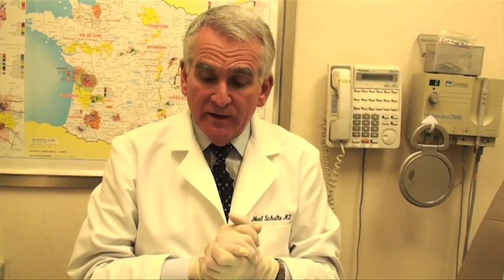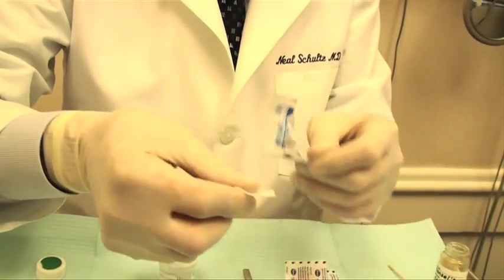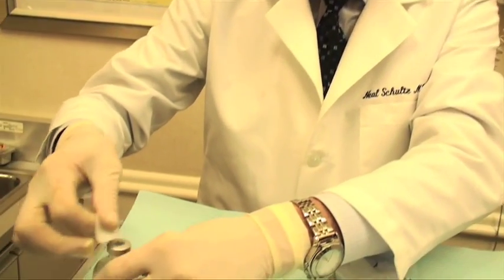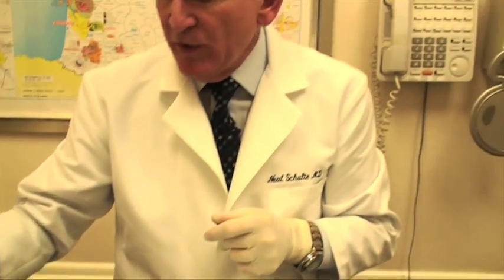So to start with, we take some alcohol, and we use the same alcohol to clean the skin where we're going to be working, and we also use it to clean the top of this bottle of anesthesia, because if we're going to scrape something off, we don't want you to have any discomfort.